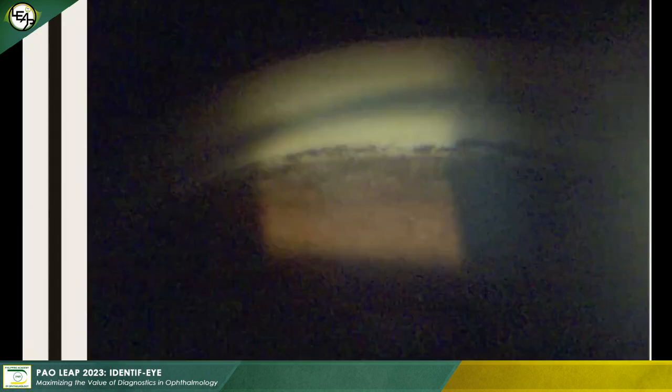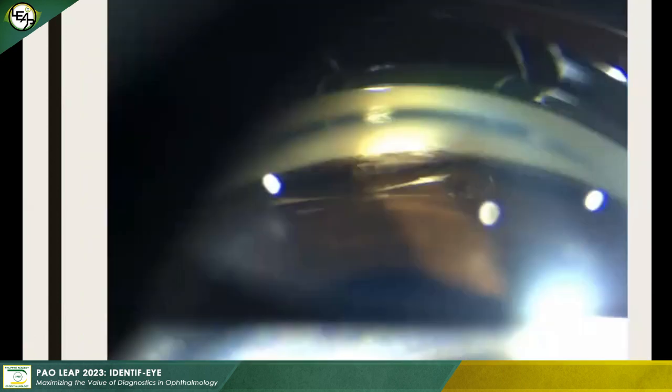Here's another variation of the angle. So here, notice that it's open. You see the various pigmented layers, the alternating pigmentation. But notice how, I'm not sure if you see it very clearly in the image, through that ciliary body, you can also see a few ciliary processes. And in this image, it's the same thing.